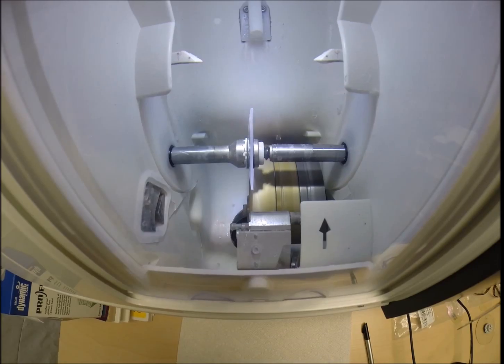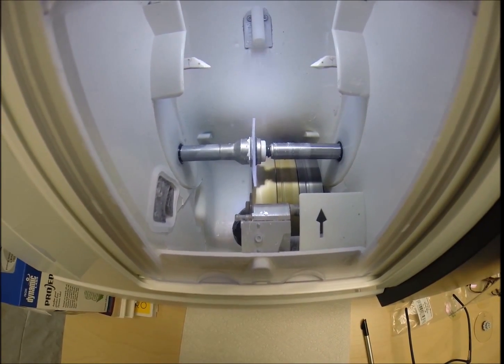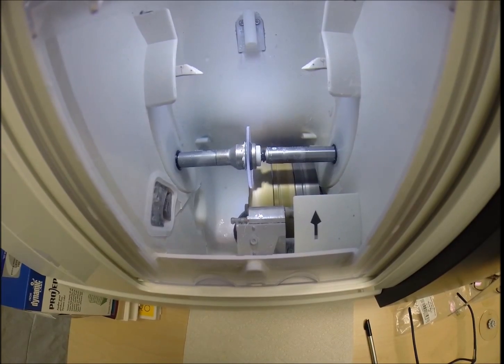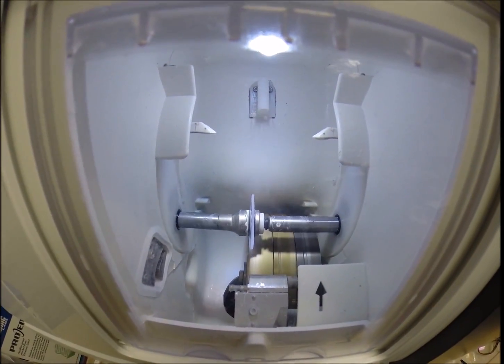Unlike the lotions, creams, and sprays that need to be reapplied every couple hours when you're in direct exposure to the sun, there on the golf course of Skyland Lakes in Fancy Gap, Virginia, this sunscreen is permanent and never needs to be reapplied. Now, if you see light flickering in the background, that is water there to catch the optical sawdust that comes off of your lens.